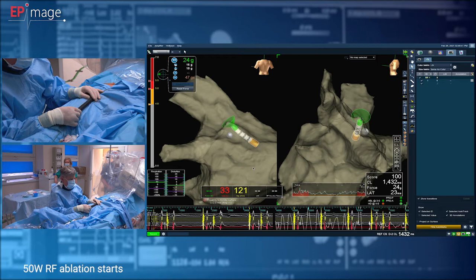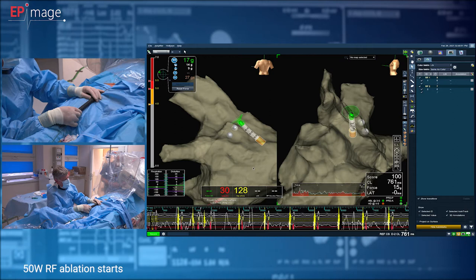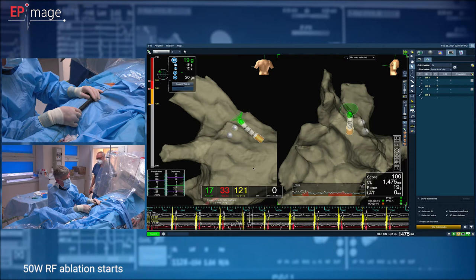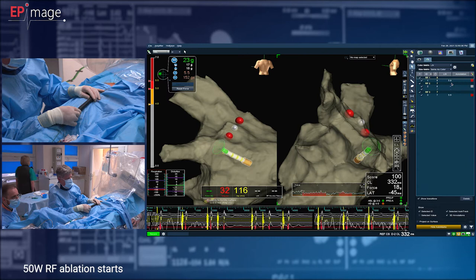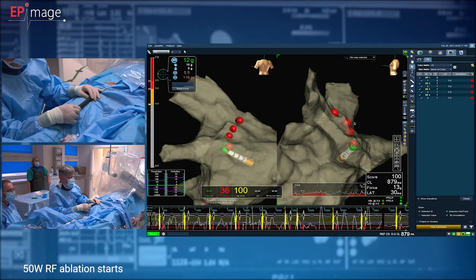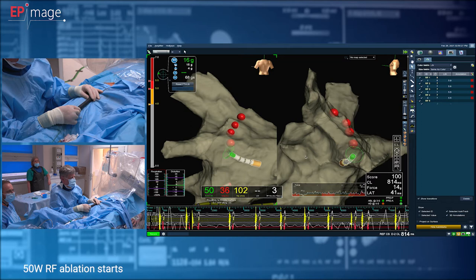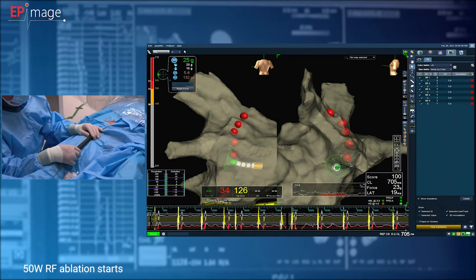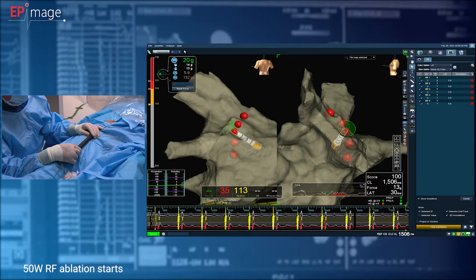As you see, I'm trying to have the contact force between 10 and 30 grams. You can appreciate how fast the application is already effective on the posterior wall. We want to have application above 4.5 LSI. It's so fast that sometimes the system is not fast enough to mark the effective point, so we need a support guy or lady who will check for us if the application points are effective. It means in our approach LSI is more than 4.5 on posterior wall, will change the color of the application into red or other color depending on the settings.